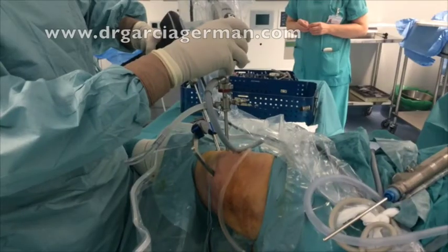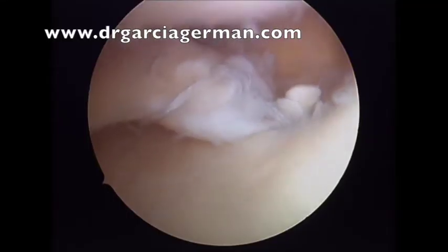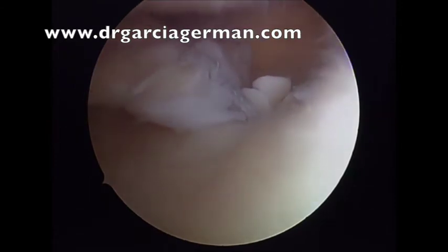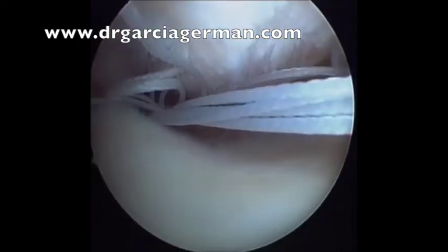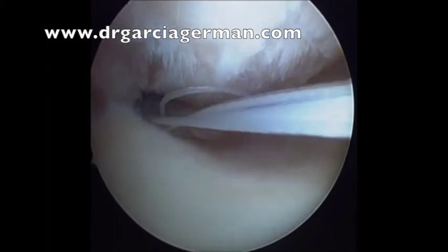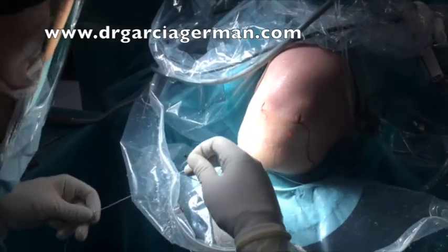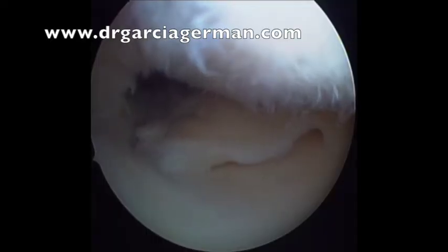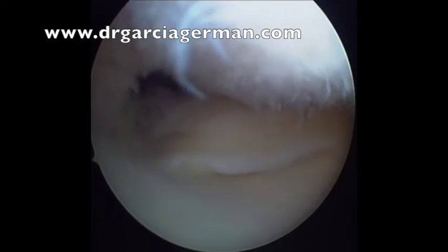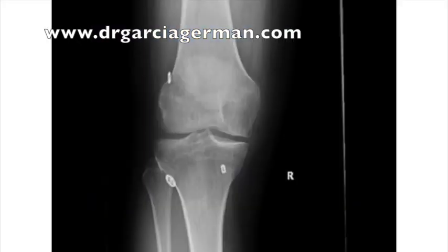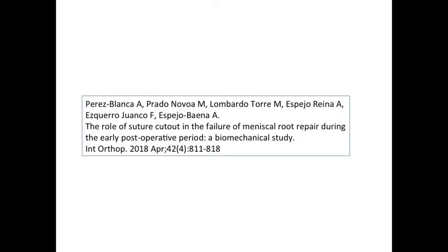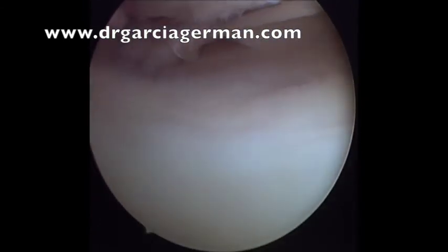We have been using the arthroscopic reinsertion technique described by Dr. LaPrade, with transosseous reinsertion drilling from the contralateral side and using braided sutures in different configurations. We found this technique may have some disadvantages, especially in terms of pull-out of the sutures through tissue that is sometimes poor quality, and also the reproducibility of cortical fixation over a button may not be so secure.